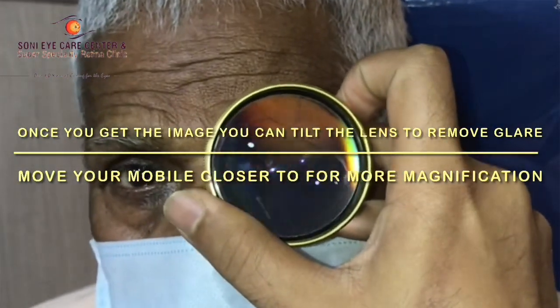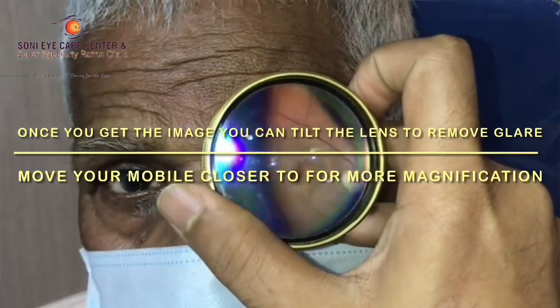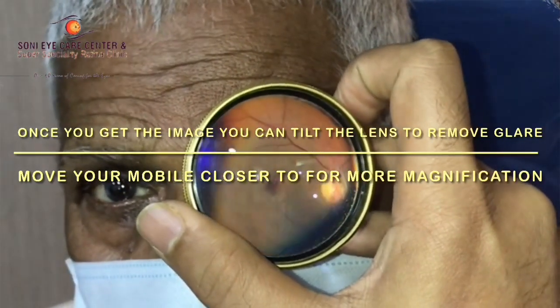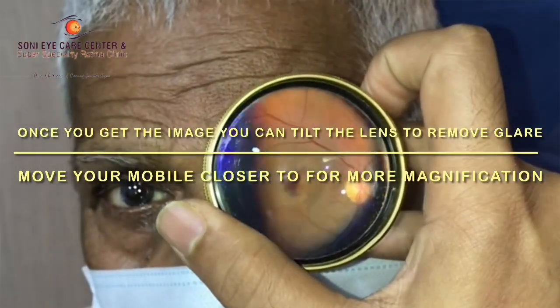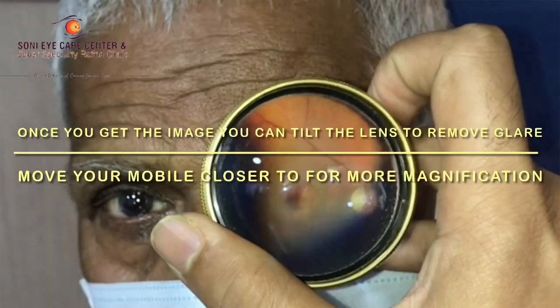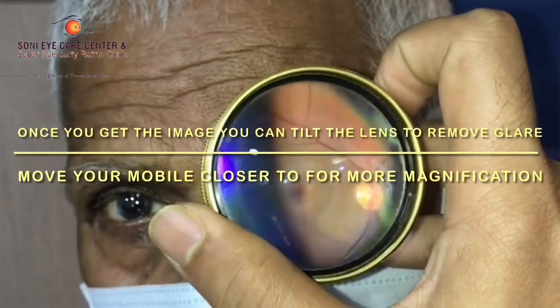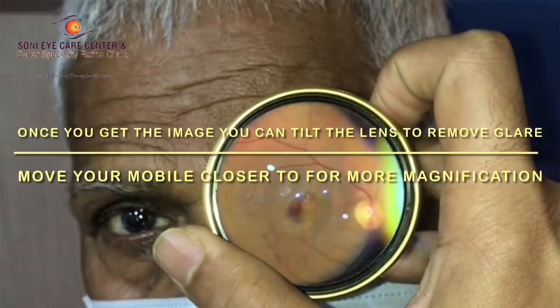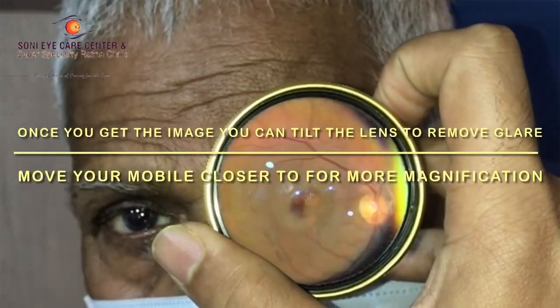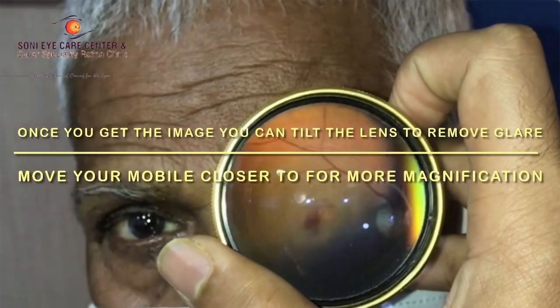Once you can find the image in the lens, just tilt the lens to reduce the glare and go close to the lens to increase the magnification. The further you go away from the lens, the field of view increases.